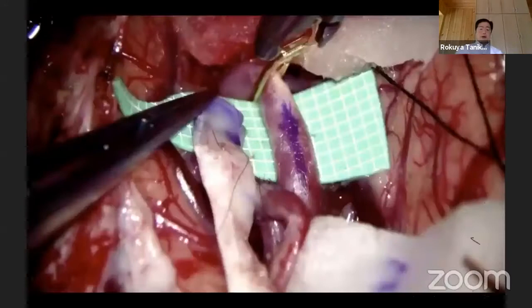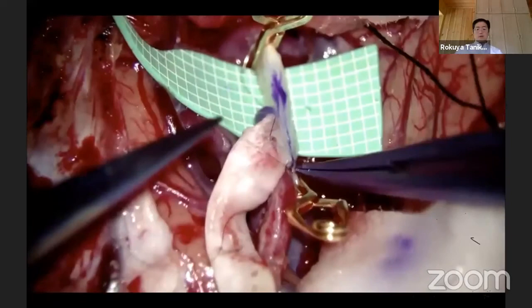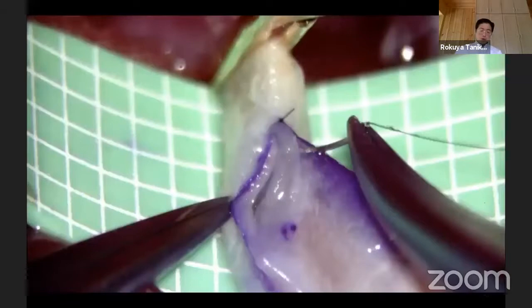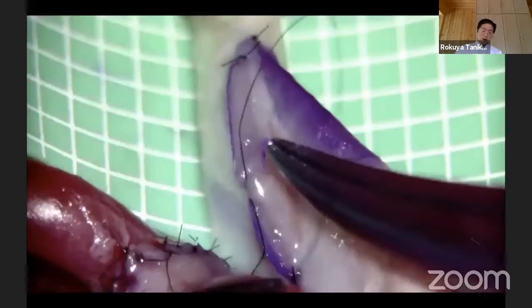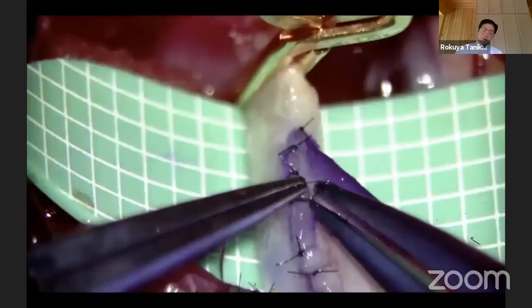This is the radial artery M2 bypass — the radial artery M2 anastomosis with a 9-0 suture. With the highest magnification you can see every detail of each vessel wall on the recipient. It's a very easy condition to penetrate both vessel walls and confirm the inside.